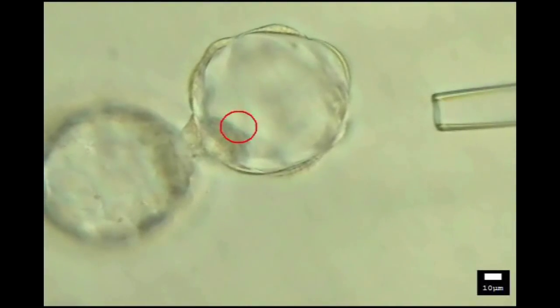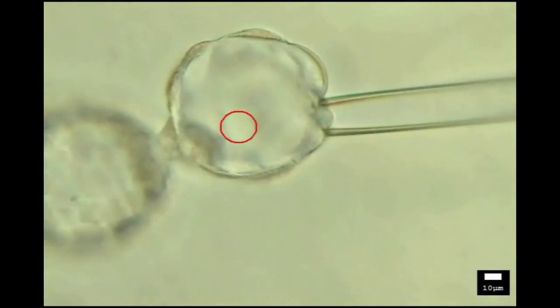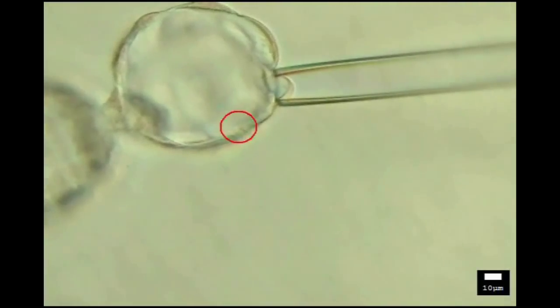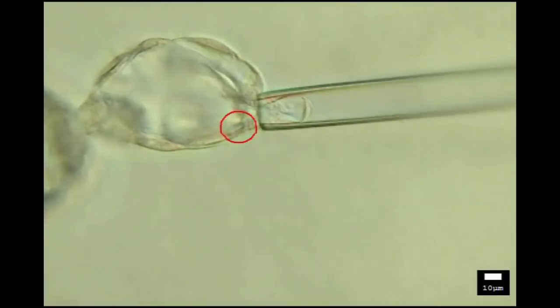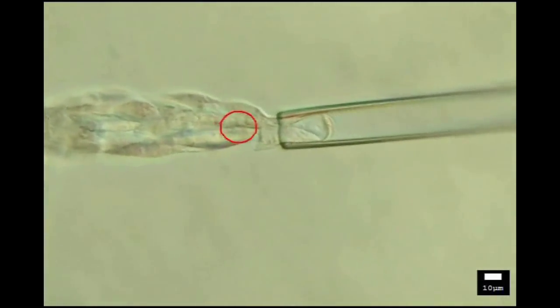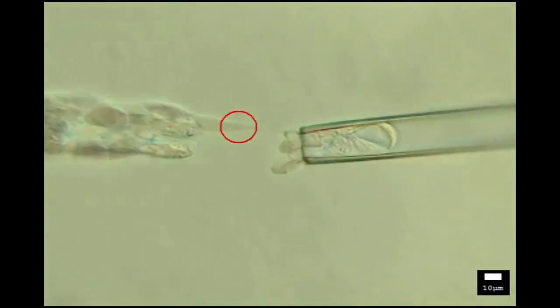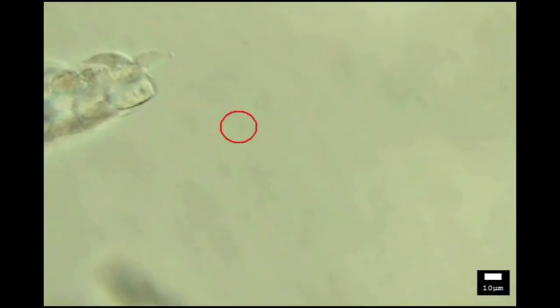A 5-AB biopsy. Again, the focus is on the trophectoderm cells, not the zona pellucida. Gentle suction pulls in a small piece of trophectoderm cells. The first laser pulse is at one cell junction from the biopsy pipette. Blastocele collapse aids the biopsy by allowing the trophectoderm cells to flow into the biopsy pipette easily. Five laser pulses and gentle pulling result in an ideal trophectoderm cell mass.